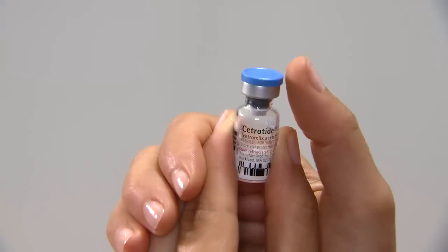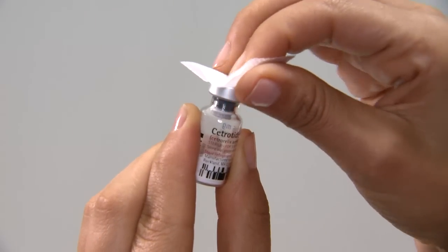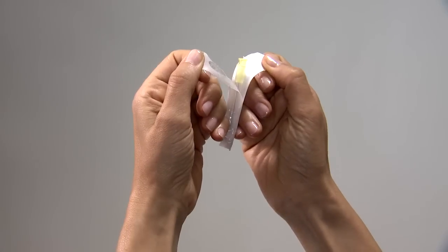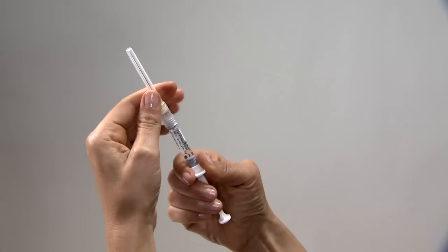Step 1: Mix. Using your thumb, flip off the protective plastic cap on the Cetrotide vial. Wipe the top of the vial with an alcohol swab. Remove the wrapping from the yellow mixing needle. Take the pre-filled syringe and remove the cover. Twist the yellow mixing needle on the syringe and remove the cover of the needle.